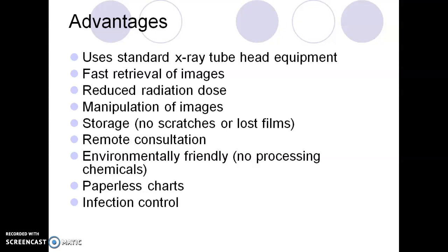Digital radiograph does have a reduced radiation dose to the patient. It takes less radiation to capture an image on a sensor than it does to capture an image on film.